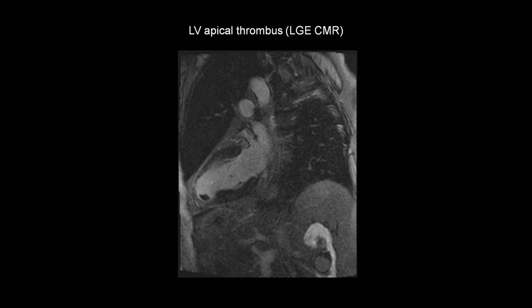This is the late gadolinium enhancement image. And now we can clearly see an area of myocardial infarction with late gadolinium enhancement at the apex. And sitting within that, in the cavity of the left ventricle, is this dark avascular area, which represents a left ventricular apical thrombus.